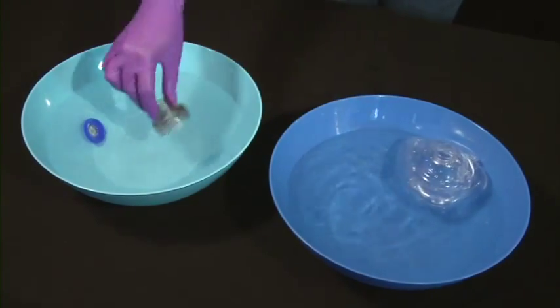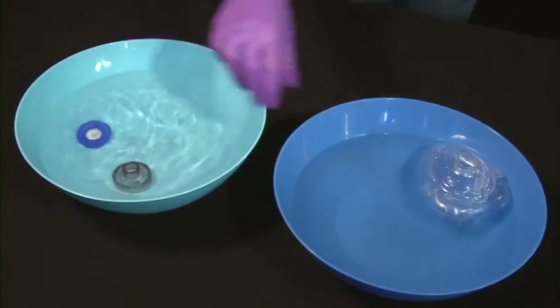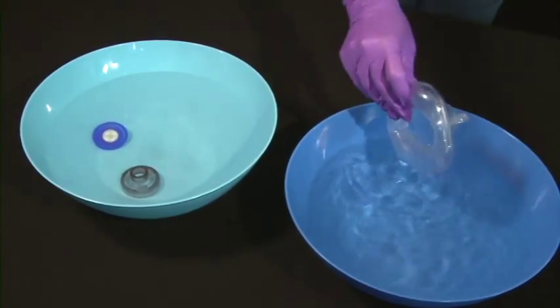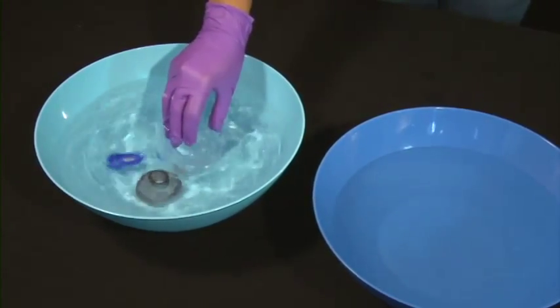One method is to soak these parts in a mild bleach solution, 10% in water, for 10 minutes. Rinse with fresh water and allow to thoroughly dry. Other disinfecting agents are available.